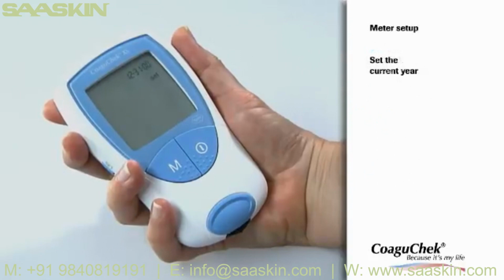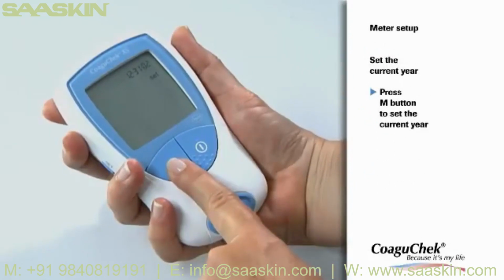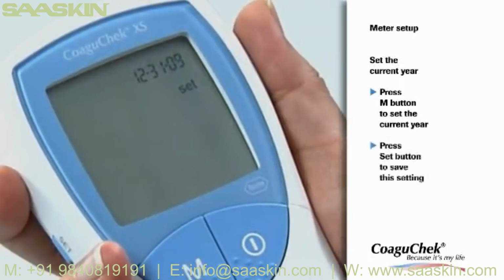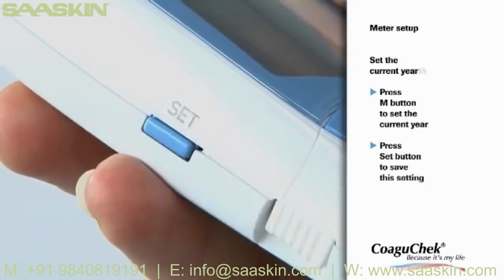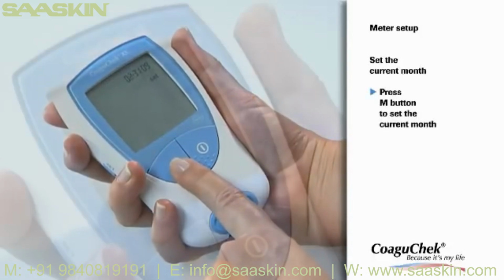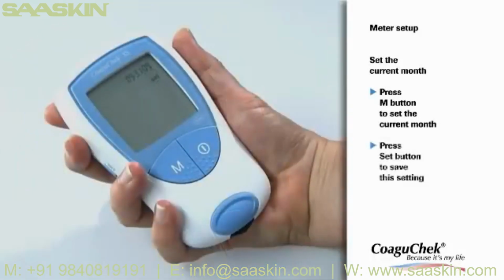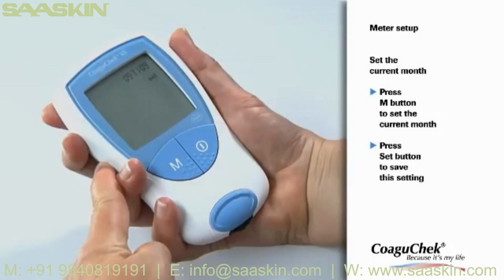The next step is to set the current year. Press the M button to change the flashing number until the correct year is displayed, and save your setting again by pressing the Set button. Now the preset month is flashing, and you have to press the M button until the correct month is displayed. By pressing the Set button, you can save your setting.